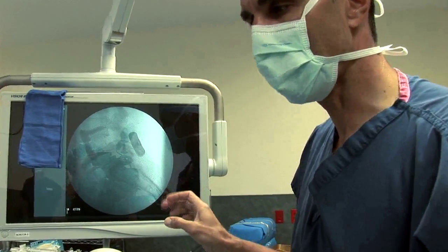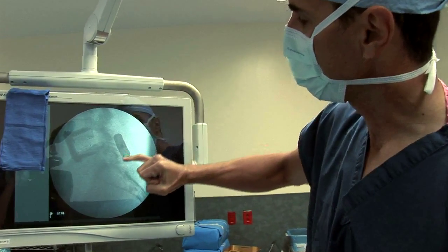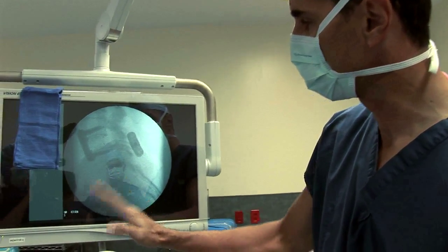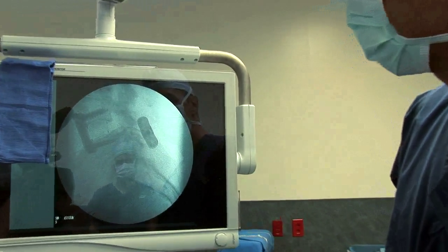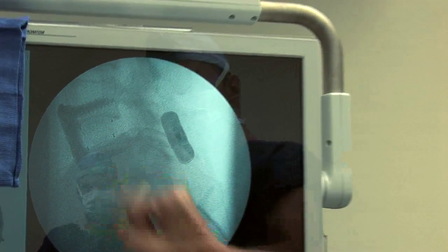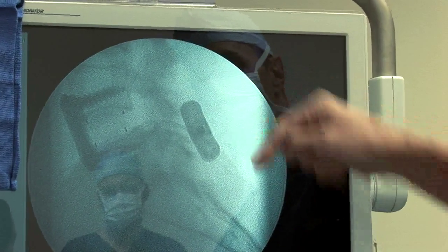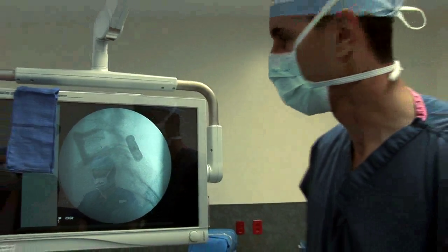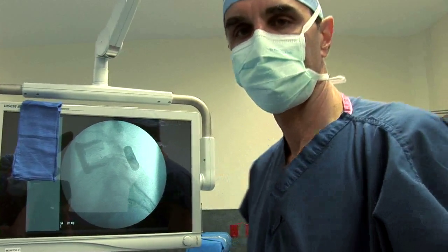You saw the MRI showing the spondylolisthesis. Now you can see the spondylolisthesis has been corrected anteriorly. We restored the alignment from anteriorly, put in the fixation device, and posteriorly put in the interspinous device. Now well aligned, there is no more stress on that level, and this should help significantly with her back pain.